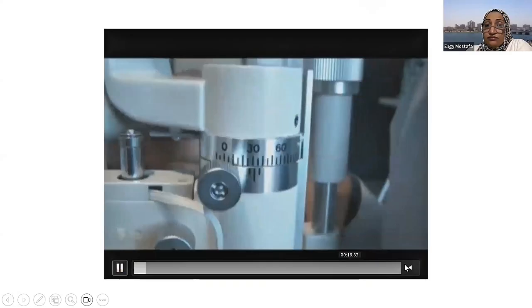Still, so now we are using this picture. Here are the directly illuminated blood vessels, and here's how they are retro-illuminated. See, this is retro-illumination. And then finally, we are putting the illumination and the viewing system coaxial.